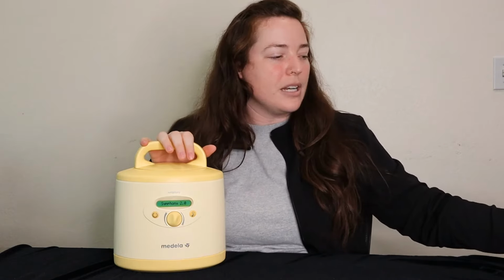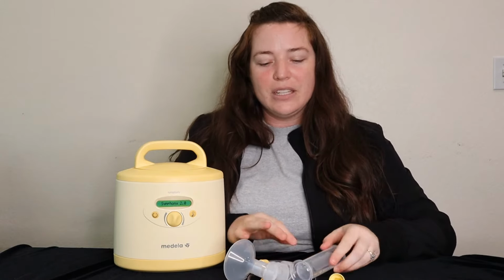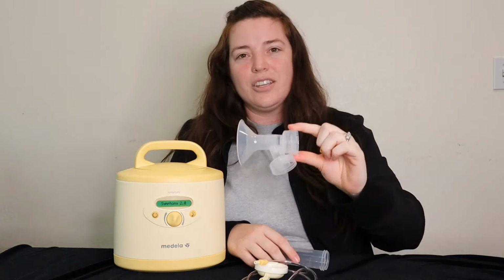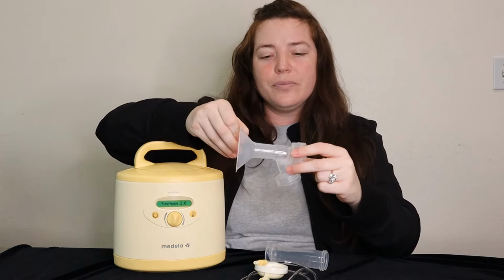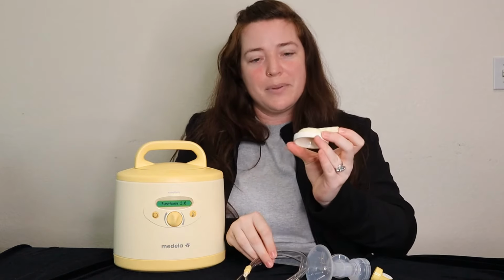Along with your pump, you're gonna need your pumping supplies. Those can also come in a kit. I'm gonna show you how to put it all together. So you're gonna have your bottle. The bottles in the kit are a little bit bigger. Your membranes, your connector with your flange, and these are customizable, so make sure you get the fit that's comfortable for you. Tubing, and our membrane that goes on the pump.